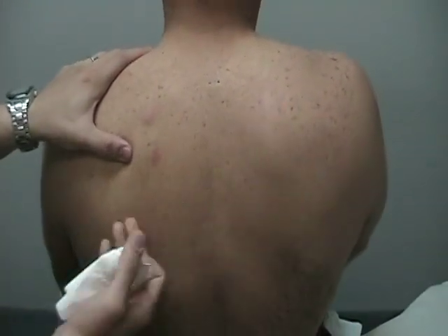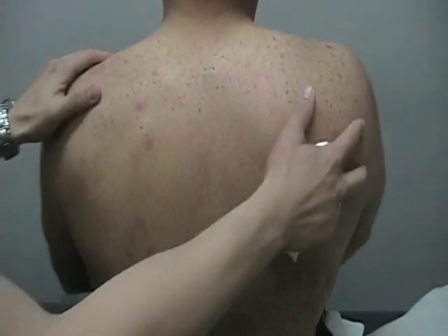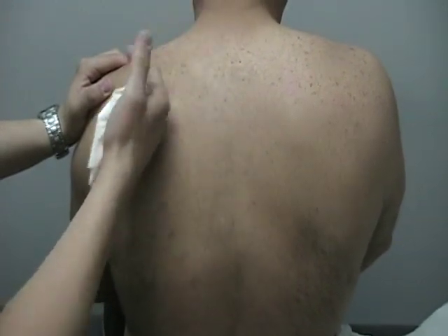The way it's going to do that is because the kinesio tape has a certain degree of stretchability or flexibility in it. So whenever his shoulders roll forward, the cutaneous receptors will pick that up and send a message to his brain, which will remind him to keep his shoulders back.